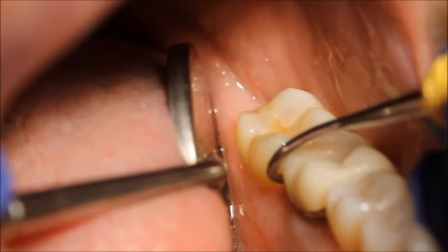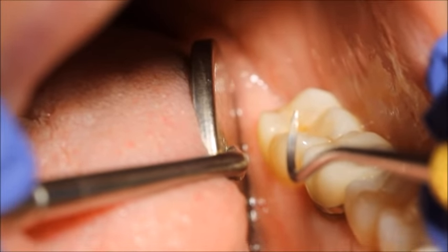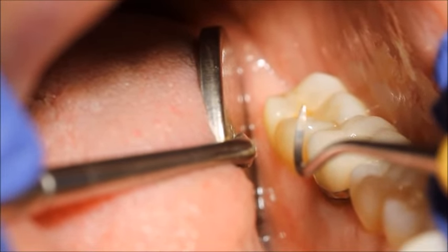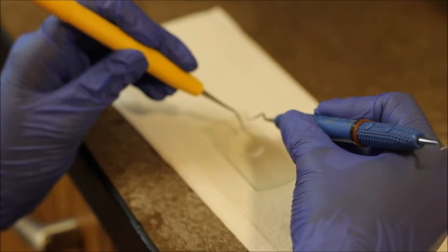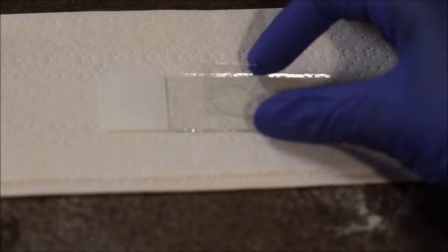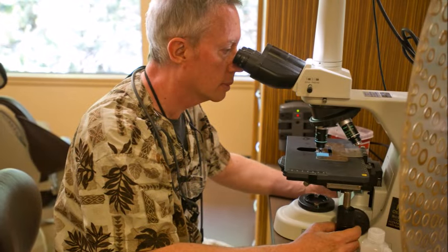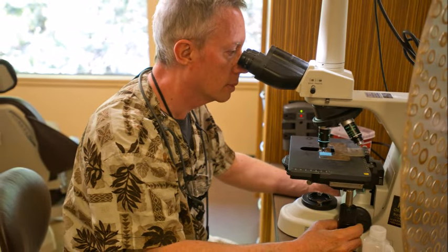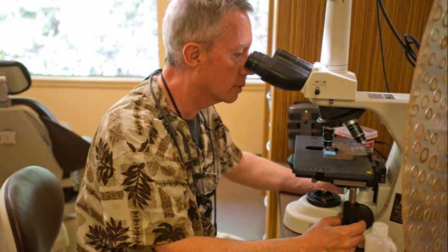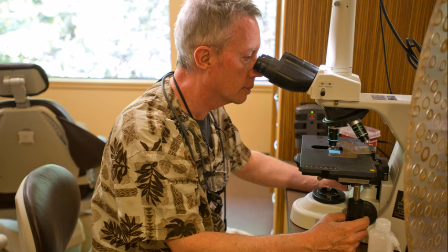Here we are taking a sample of plaque from just under the gum line to go onto a microscope slide. Plaque is a biofilm containing a wide variety of bacteria, and the delicate lining of the gum tissue is sensitive to the bacterial toxins that are produced. When this biofilm stays in contact with the gums, particularly just under the gum line, this creates a true bacterial infection. When we look at this plaque under a microscope, we can see a profile of what types of bacteria are in your plaque.